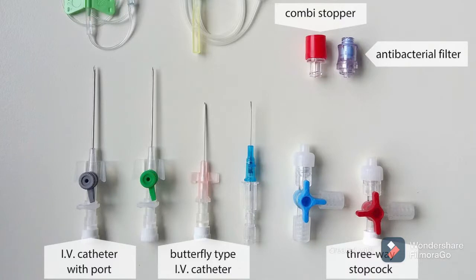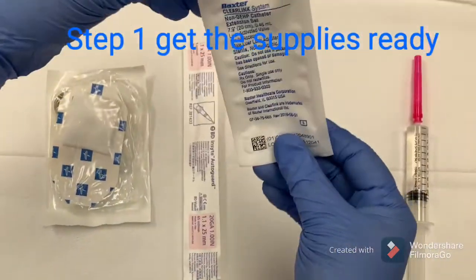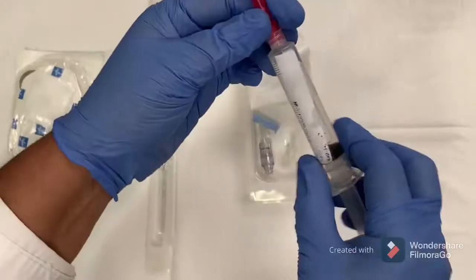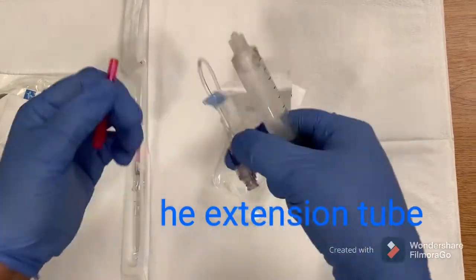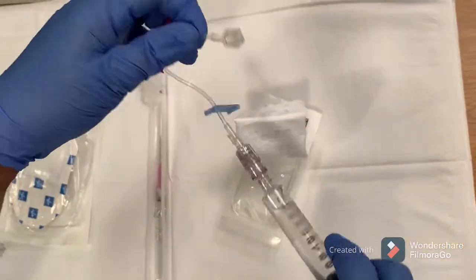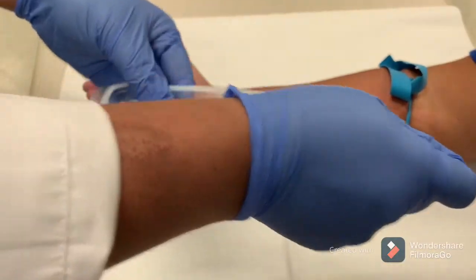Get all the supplies ready. Find the extension tube with a 10 ml flush, connect it with the flush, and flush and expel all the air from the extension tube.